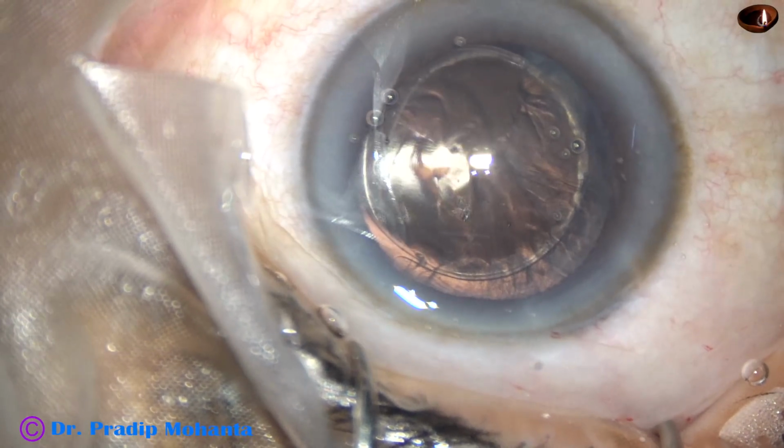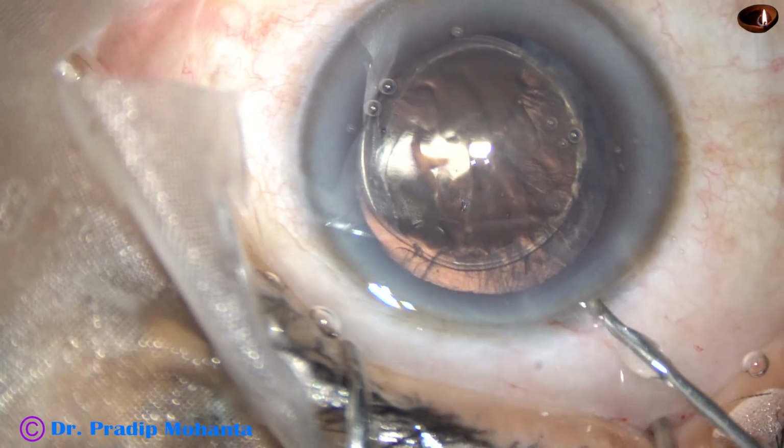The viscoat is still plugging the posterior CCC.